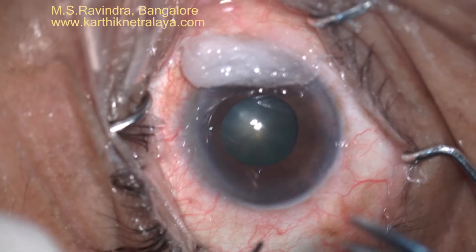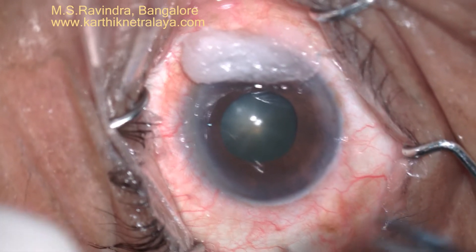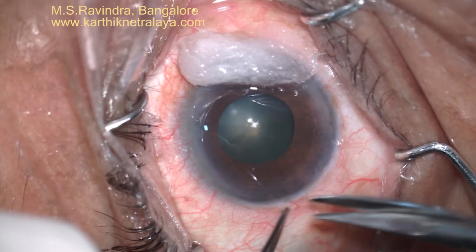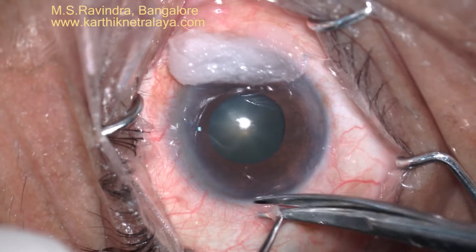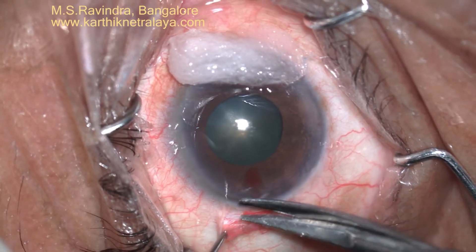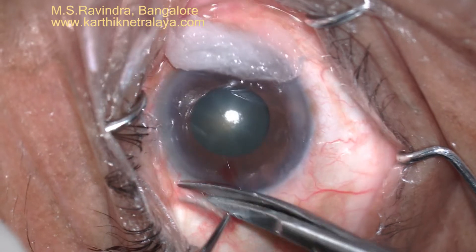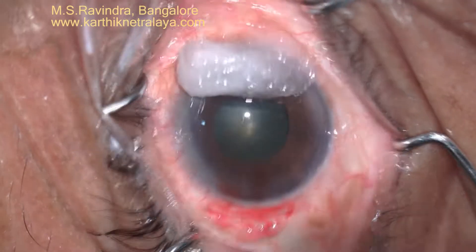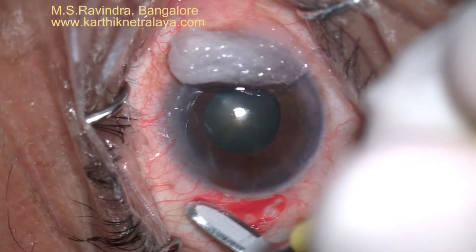An eye with a pupil that dilates only to about four to five millimeters and has IFIS is being operated. A sponge soaked in tropicamide and phenylephrine is placed at the opposite limbus.